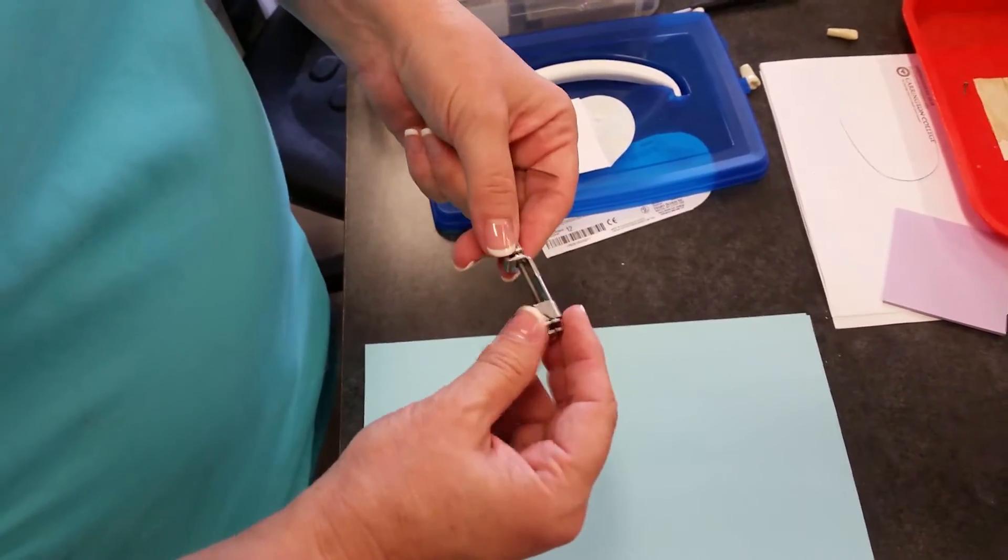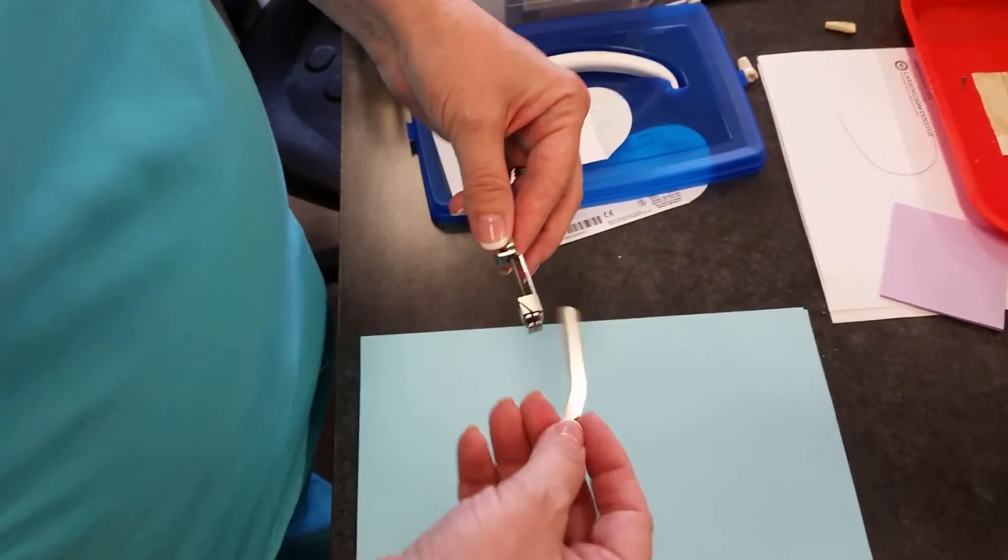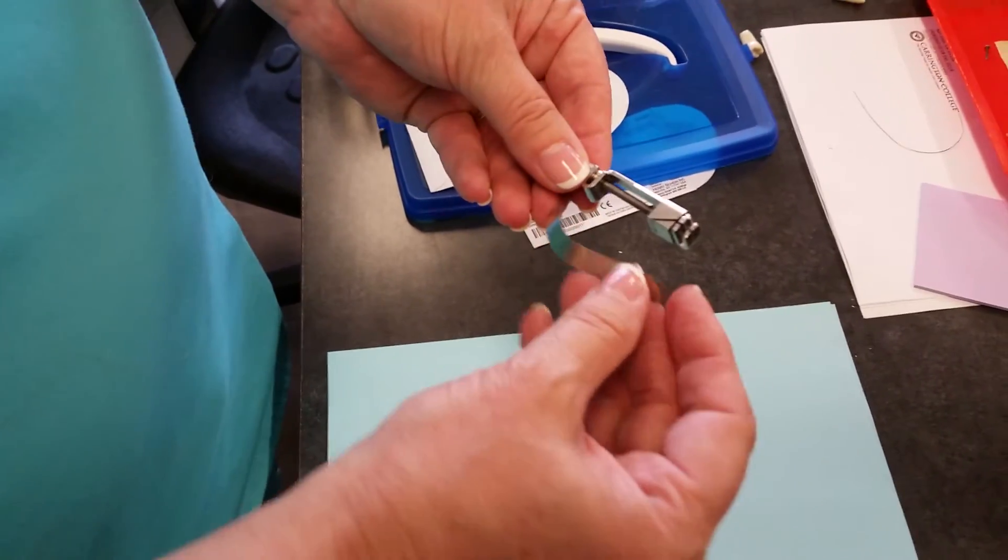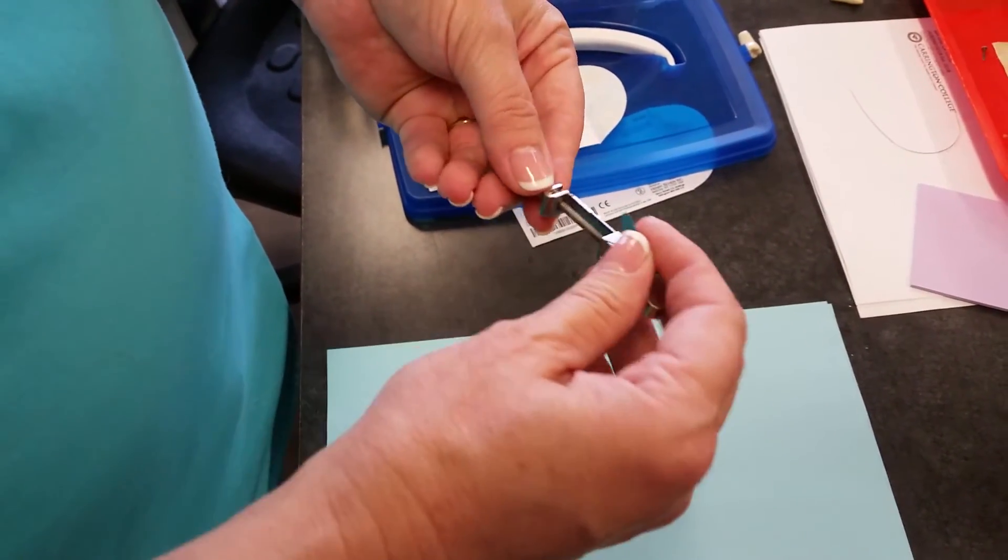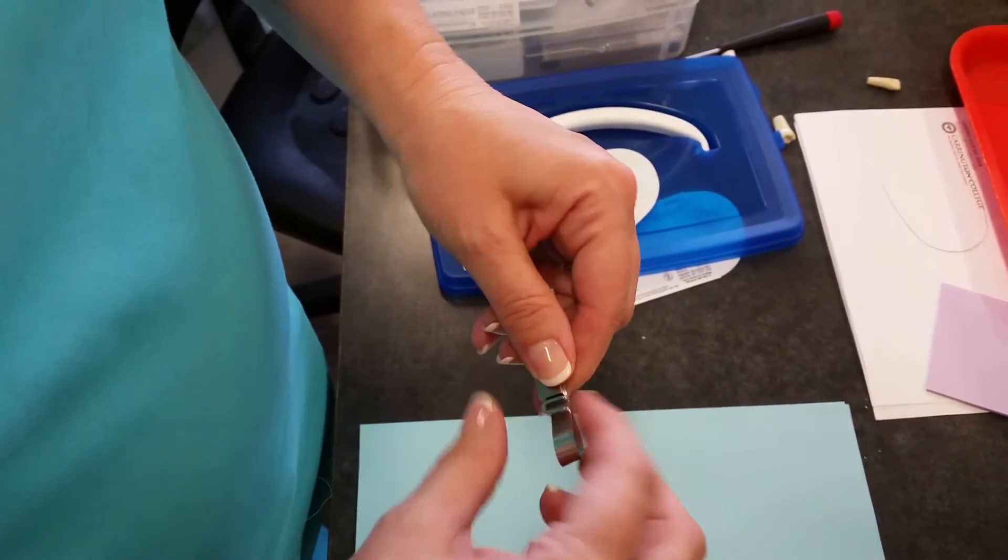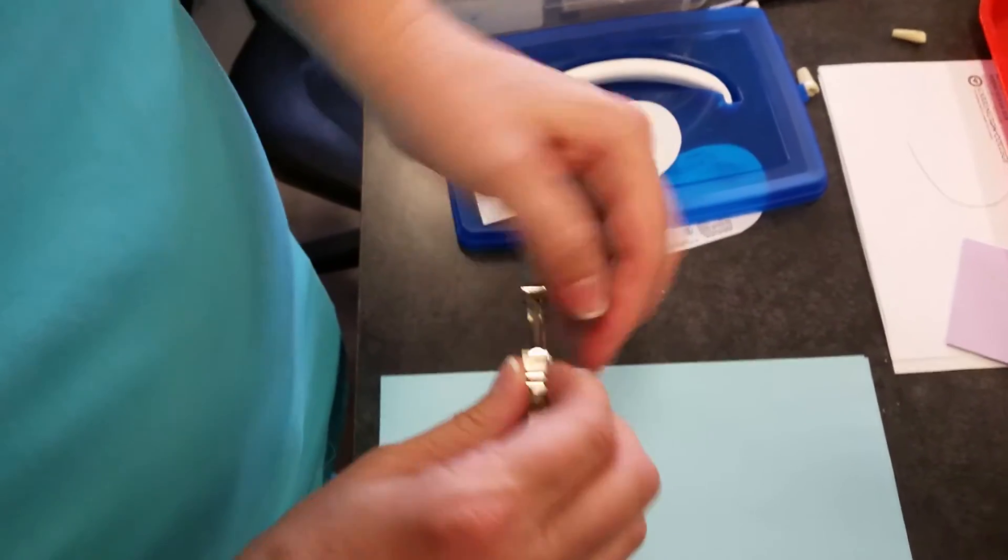The block is against the guide channels and then you have your matrix which is going to be smiley side facing up. So smiley up, guide channels up, place it right into the guide channels with just a small little tail sticking out.